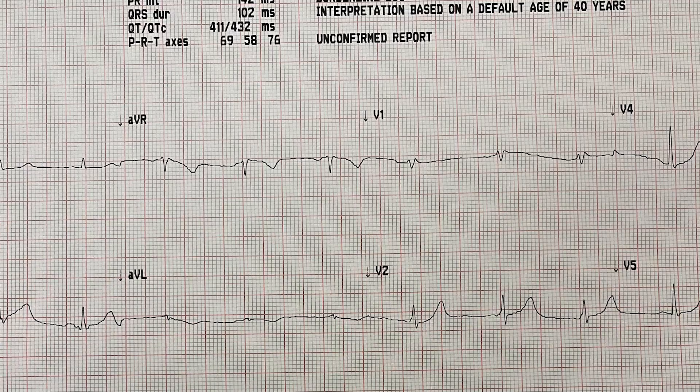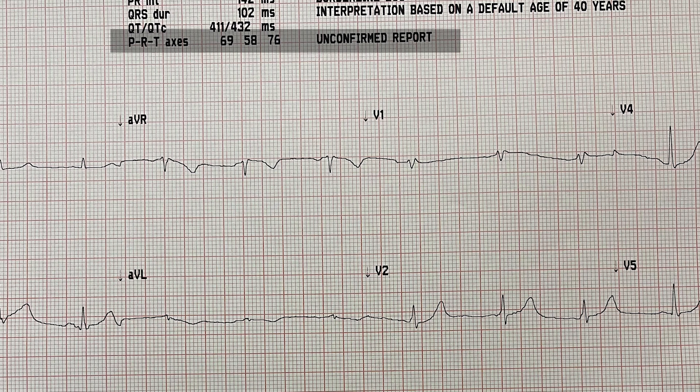Now you see how easy it is to determine the cardiac axis. From now on, use this method to determine the cardiac axis on any EKGs you come across, then confirm it with the computer interpretation. Most EKGs nowadays will have the computer interpretation, which includes what we call the QRS axis — the cardiac axis given the ventricular mass makes most of the heart mass. This is usually an accurate, fast, and easy way to find the cardiac axis if you want to save brain energy. There is also P wave axis and T wave axis, but those are less important at this point.